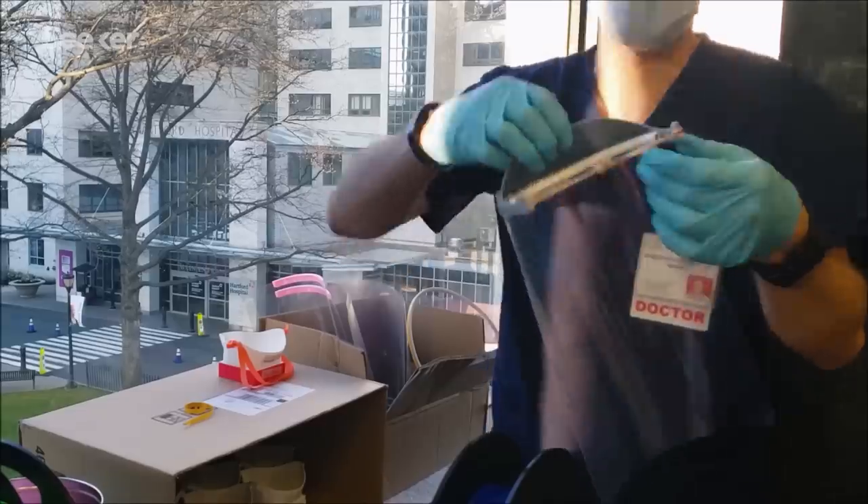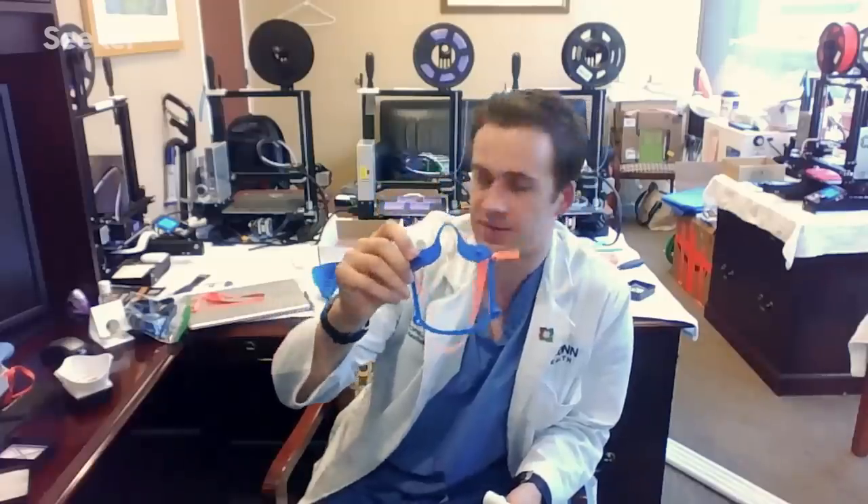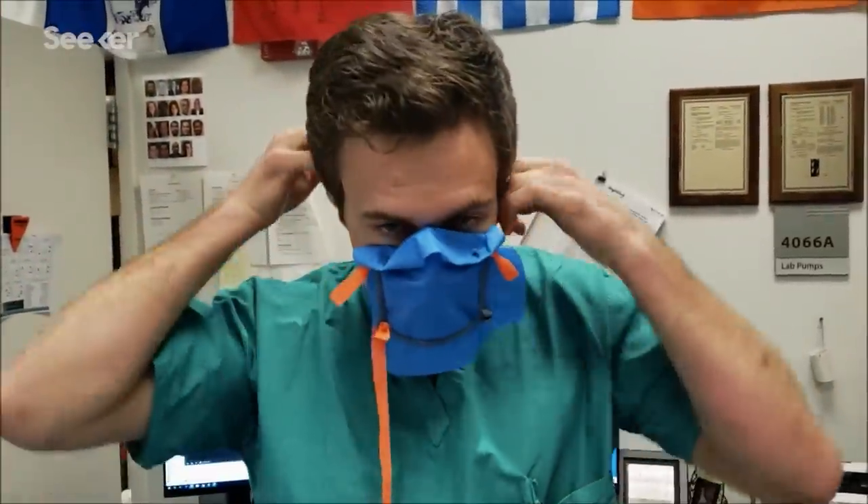Currently, we are printing face shields made from the 3D-printed orange part you're seeing here. We're also printing frames that can hold alternative types of material to your face. We're making ventilator splitters, though I really hope not to have to use these, as well as our primary project, which is the respirator full face mask.